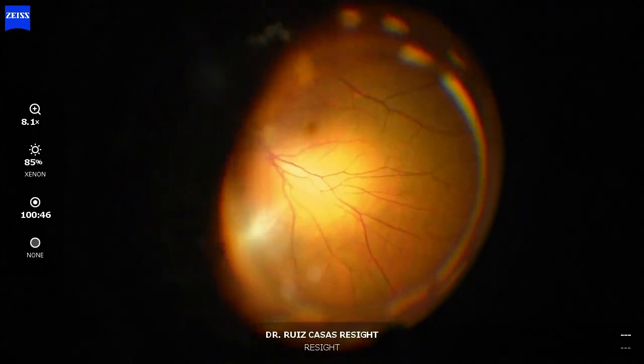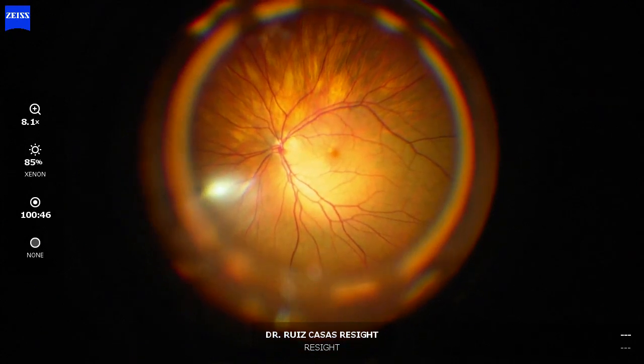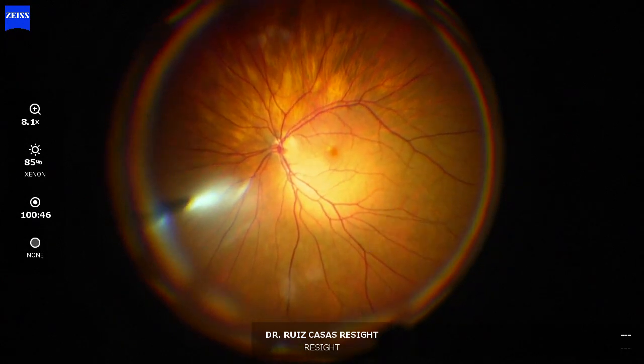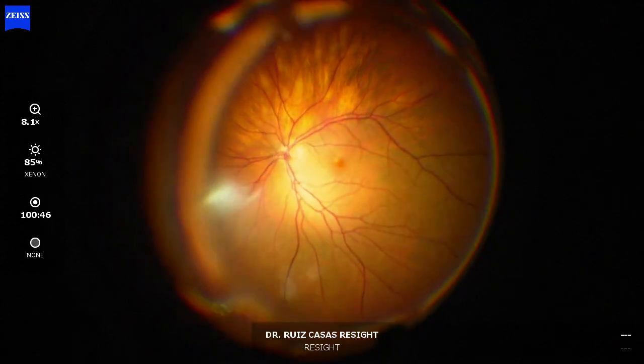These vessel crossings we will use as a landmark to compare with other lenses. The first lens I'm going to compare is with the new disposable yellow lens.